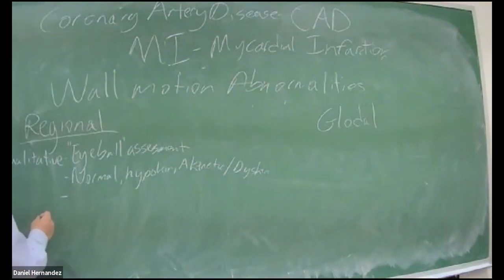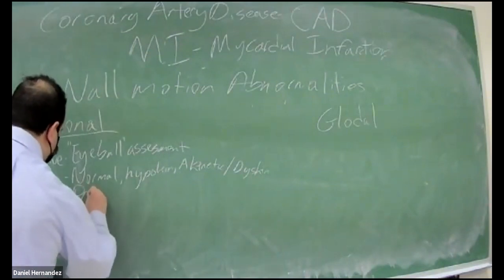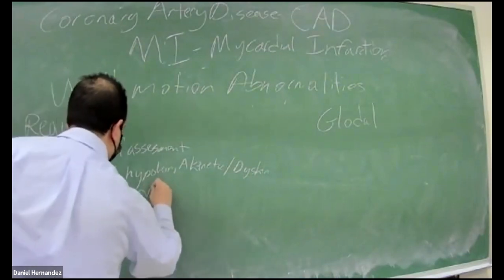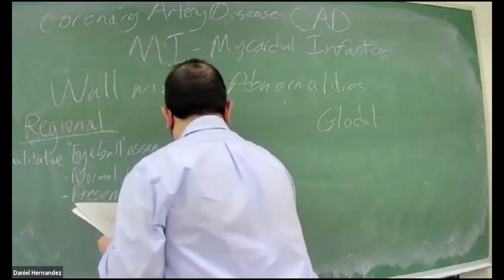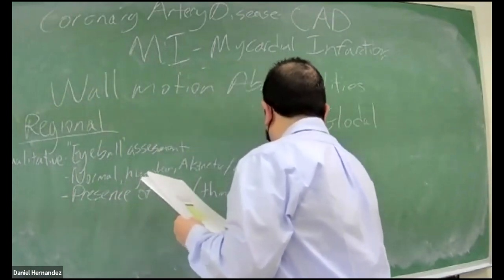We can look for the presence of scar or aneurysm.